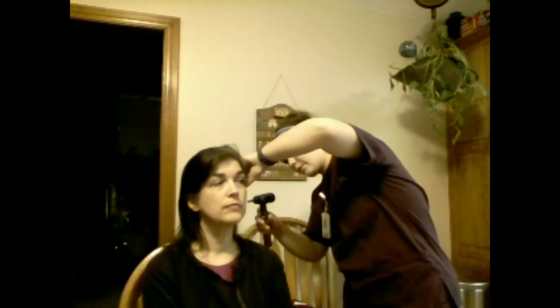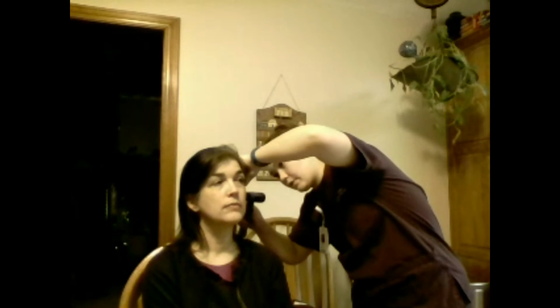Next, I'm moving to the ears, so I'm going to start with the outside of the ears, looking for any signs of drainage or any kind of lesions or abrasions within the ear. I do not see any on the left, and I do not see any on the right. Then I will be moving into the inner ear with my otoscope, and I'm going to be looking through the ear canal all the way to the tympanic membrane, just making sure I'm pulling the ear up and backwards a little bit for my adult patient.